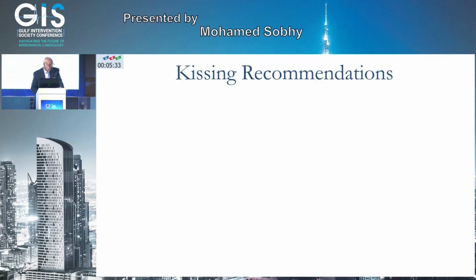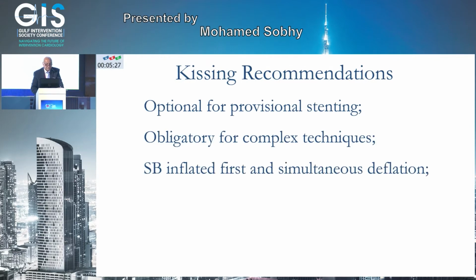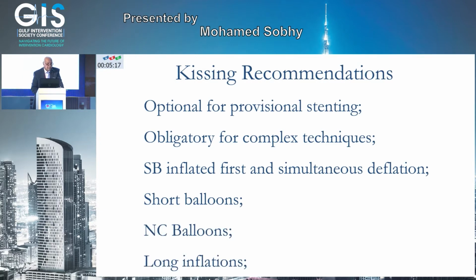Kissing recommendation. Do you have a recommendation? Yes. It's optional for provisional. It's not routine. It is obligatory for complex. The side branch is inflated first with simultaneous deflations. You have to use short balloons, non-compliant balloons, and long inflations.